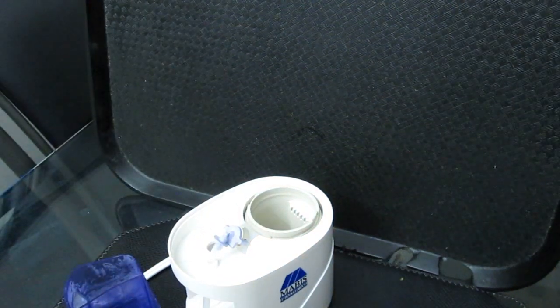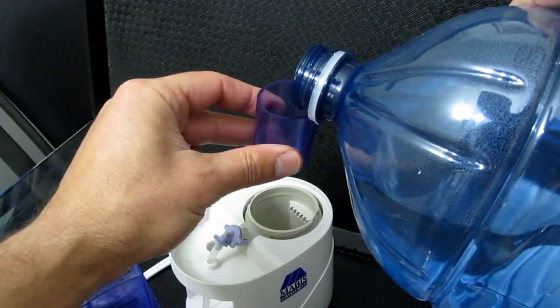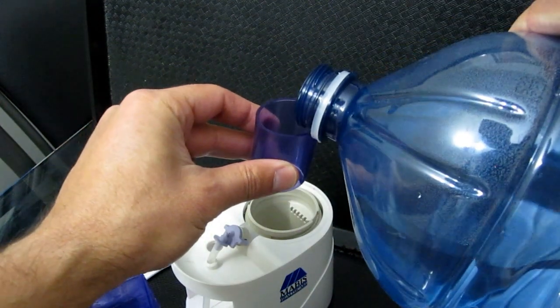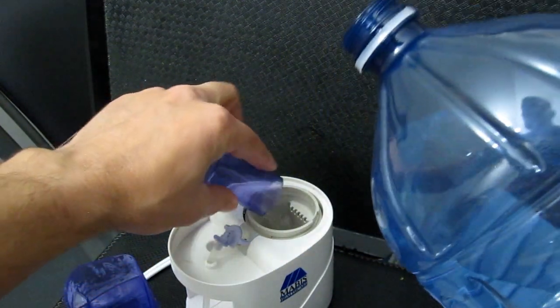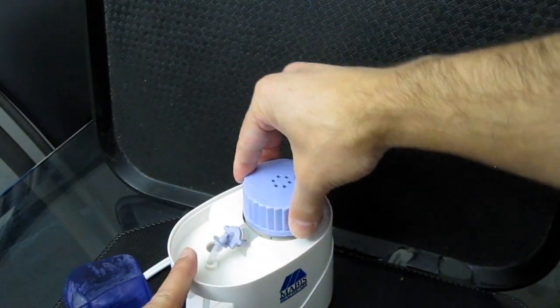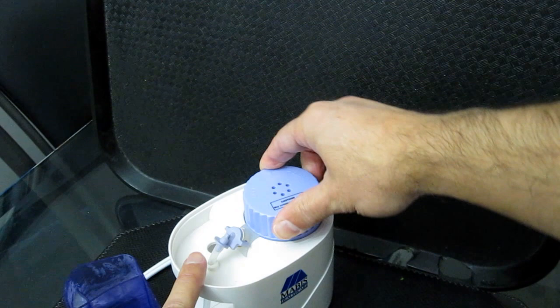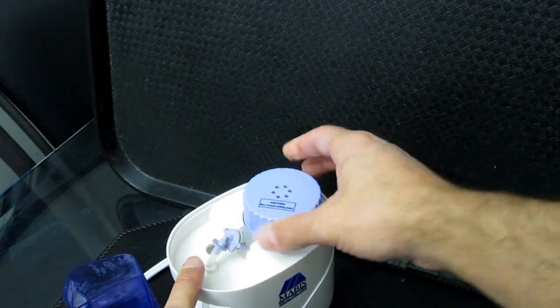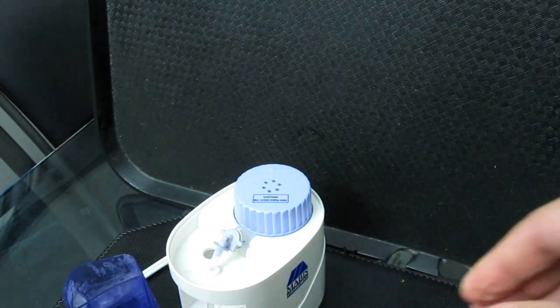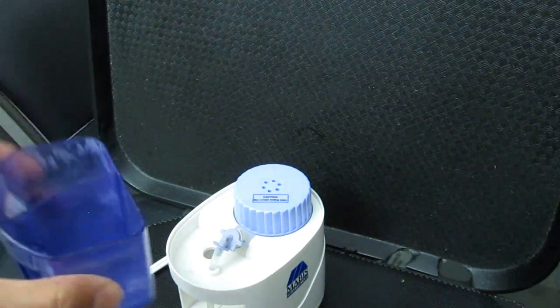It comes with this little measuring cup, but I'll use it just because, why not? Anyway, you can actually put, I think, up to 4 of these, but you don't need all of it. That's about it. Screw the lid on tight. Make sure you don't move this around. Oh, actually, right after you're finished, be careful if you open this up. There is still some steam that remains in here. You can get scalded. And obviously, steam has the most energy in it. It's worse than a burn from hot water.